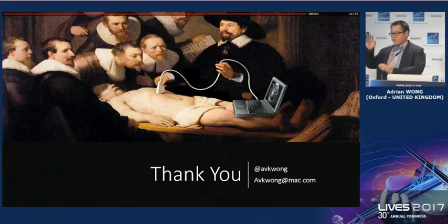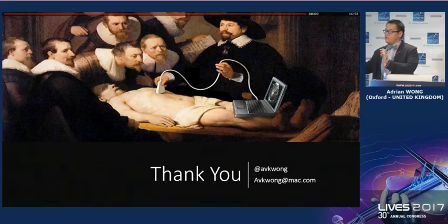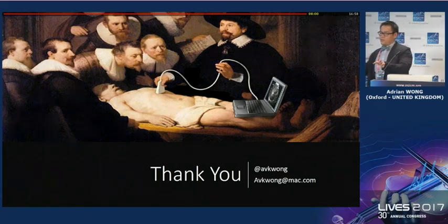I think what people think is that this is the be-all and end-all of it. If you put your ultrasound echo probe on it, it will give you the firm answer. You need to complement it with the clinical examination and clinical history. A patient may have both. A patient may be short of breath because of a combination of both cardiogenic and non-cardiogenic pulmonary edema. With this, you can actually say, I think he's got an element of both. Without ultrasound, you may not be able to tell if it's both, if it's one or the other. It allows you to separate out those three, I think.